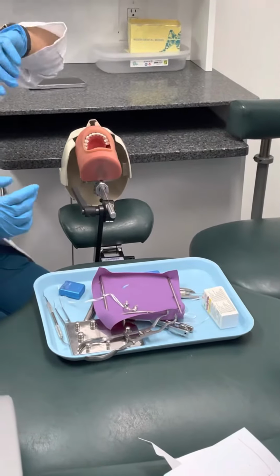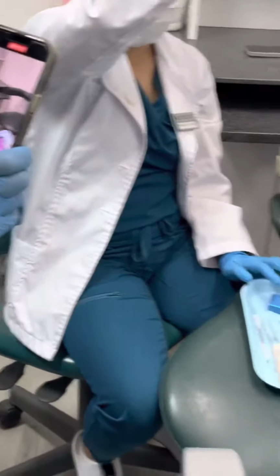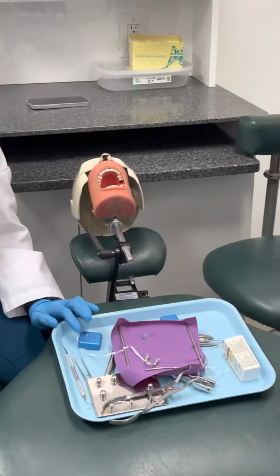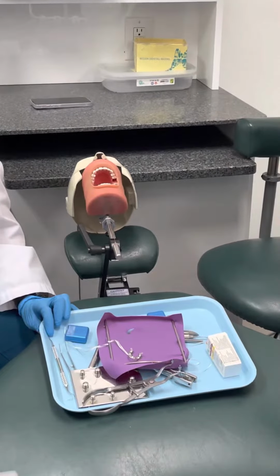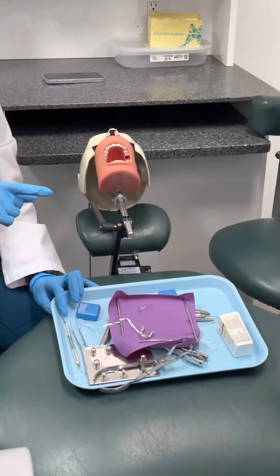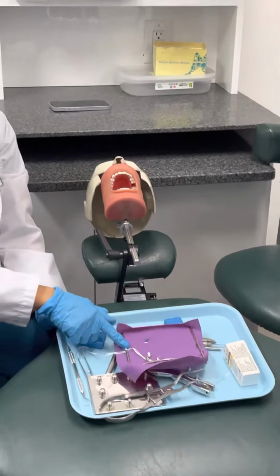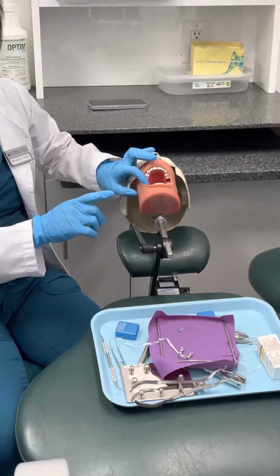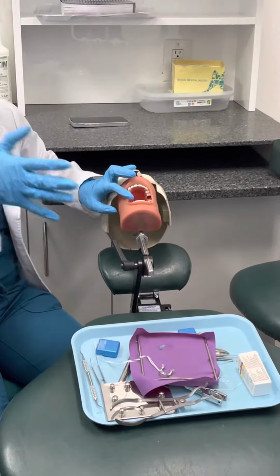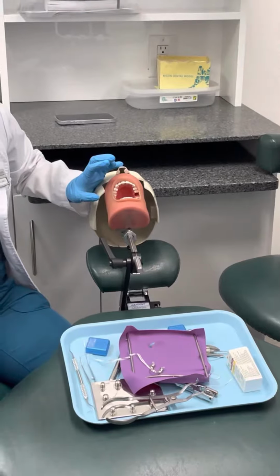If I don't want to. What are the situations? One is if the working tooth is the wisdom tooth or the last tooth, you cannot work, unless it's a root canal, right? Root canal, we now always use a dental dam because your working tooth is your clamp tooth. But if it's a restoration and your working tooth is the wisdom tooth, there's no tooth behind it. So where can you clamp? Nothing, right? So you cannot use a dam.